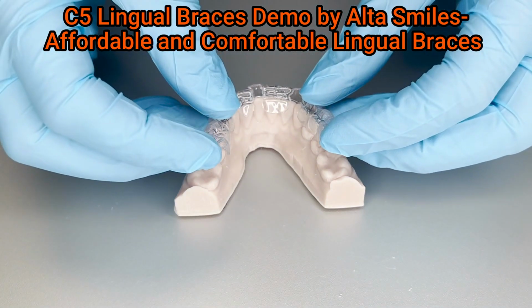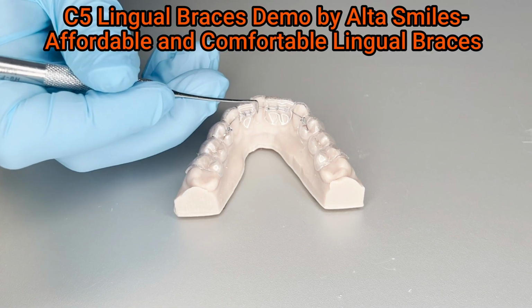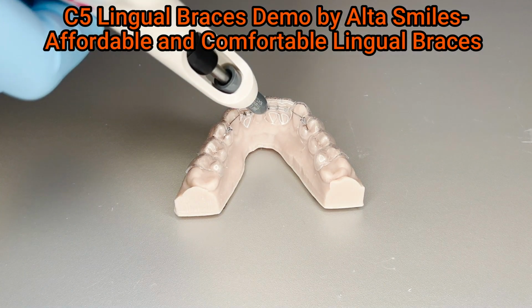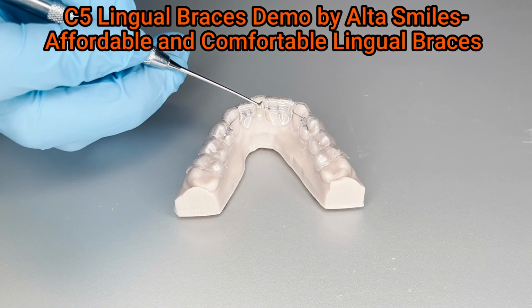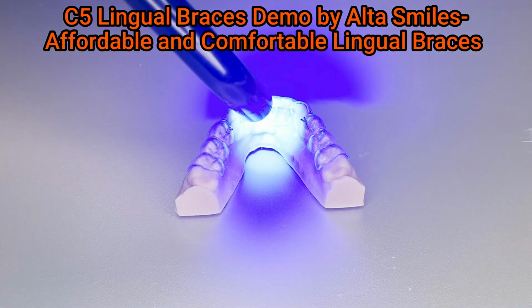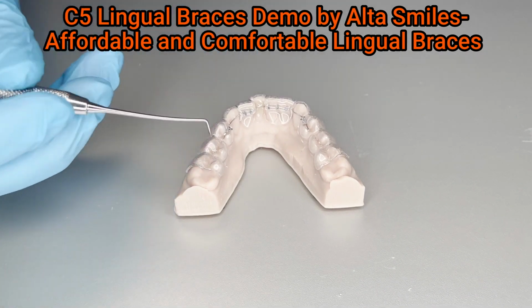After preparing the teeth for bonding using etch and primer, place the ProWire single-layer indirect bonding tray over the teeth. Ensure that the tray is fully seated. Starting with the exposed tooth closest to the midline, use an explorer to adapt the ProWire to the lingual surface of the tooth. Place composite over the wire and smooth it with a microbrush. Swipe the explorer along the opening of the indirect bonding tray to remove any excess composite prior to curing. Cure the composite using a curing light according to the manufacturer's instructions. Repeat these wire adaptation and bonding steps on the remaining exposed teeth.